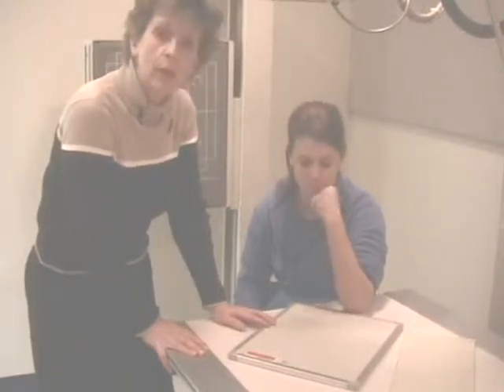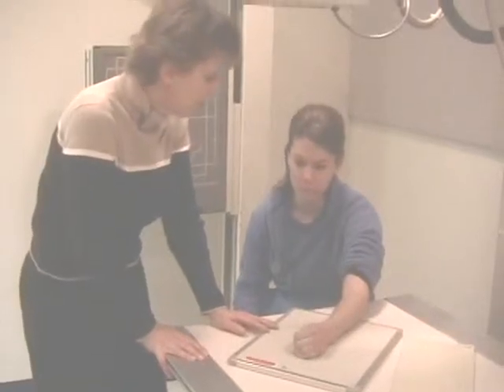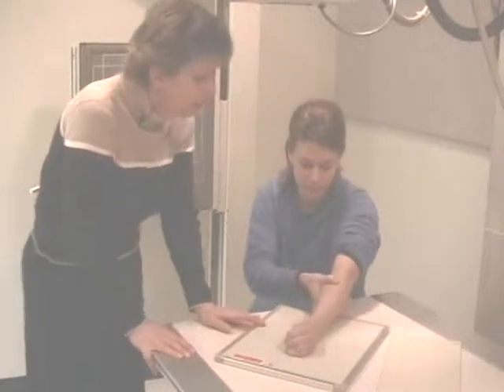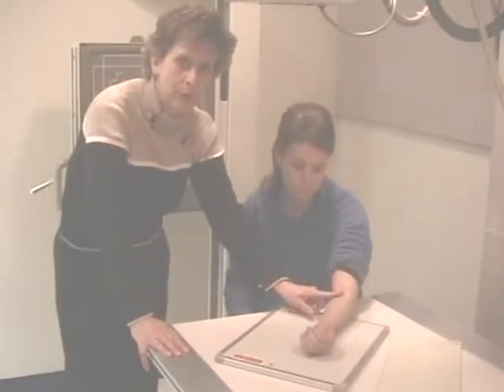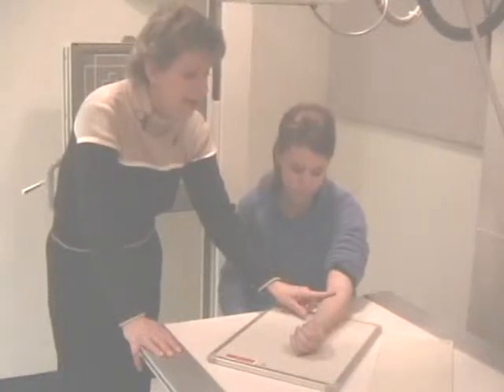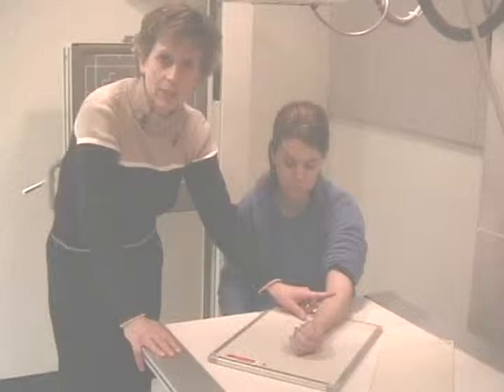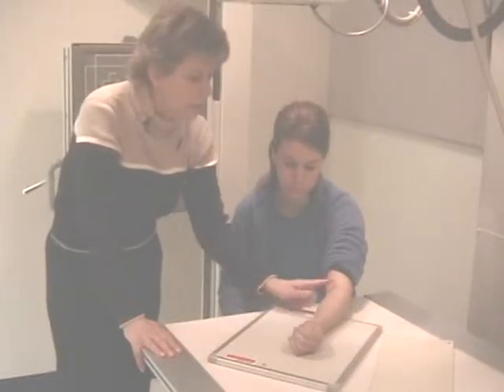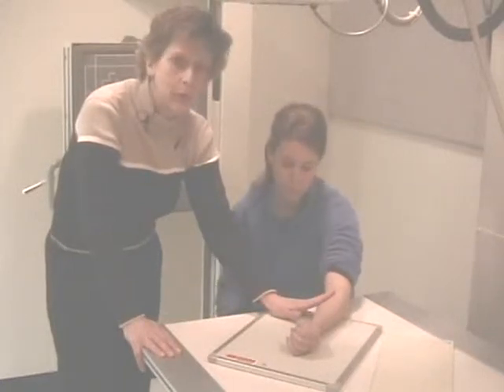Before I can actually decide where I'm going to put my ID blocker, I need to talk to my patient. Drea, where'd you hurt yourself? Where's your most pain? And if you notice, she's touching closer to her elbow. That would be defined as a proximal forearm. The emphasis will be placed on the elbow rather than the carpals. We're going to include both joints, but the proximal end is going to be more important.